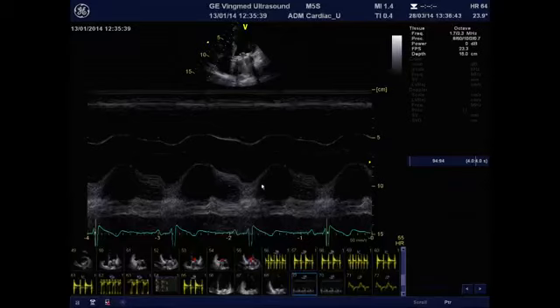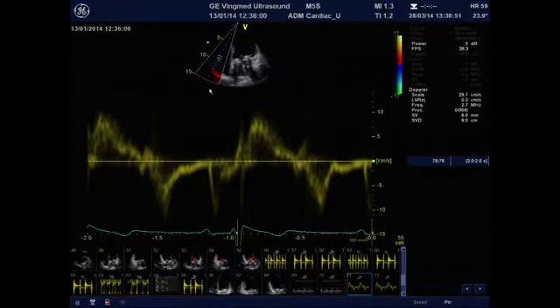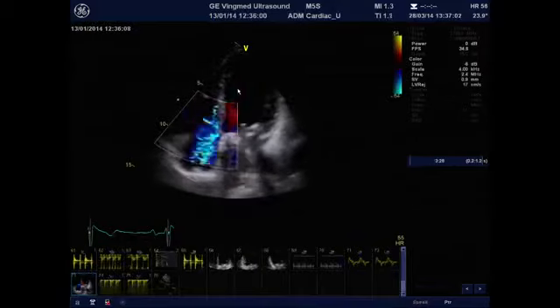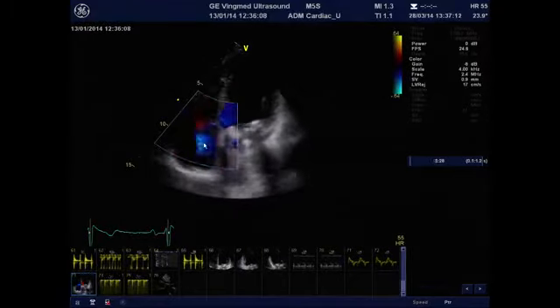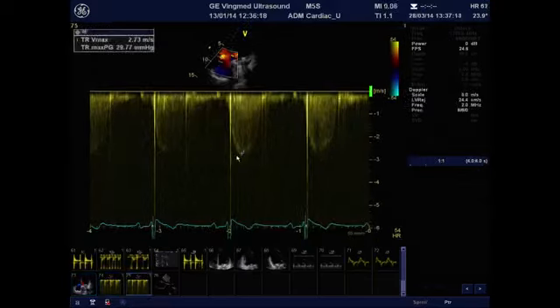You can do this by assessing the TAPSE with the M-mode on the tricuspid annulus, and also the systolic velocity at the tricuspid annulus with the pulse wave Doppler and the tissue Doppler imaging. And you should, of course, assess for the presence of significant pulmonary hypertension using the tricuspid regurgitation with the continuous wave Doppler, and measure the max velocity to assess the transtricuspid gradient.